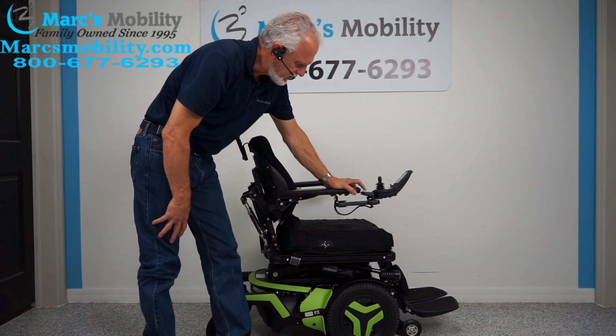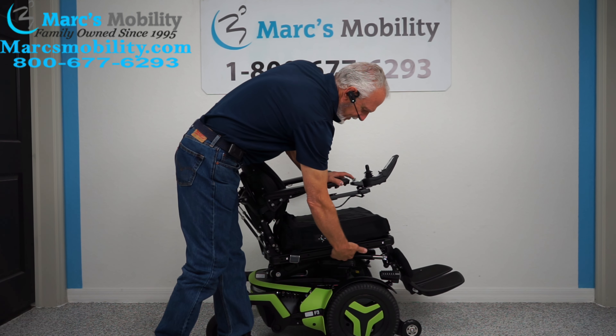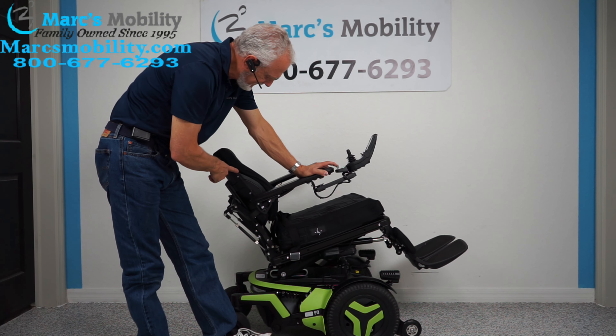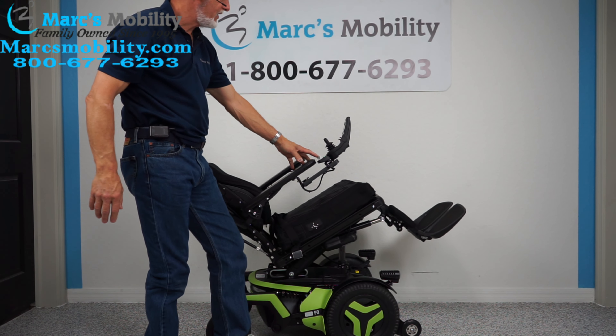The next feature is called the electric tilt. The electric tilt is when this base goes back, taking the legs and the back with it because they're all connected together. This is called the electric tilt.